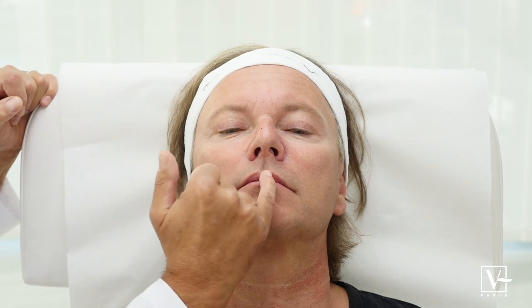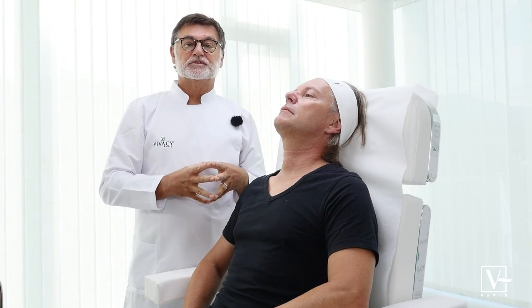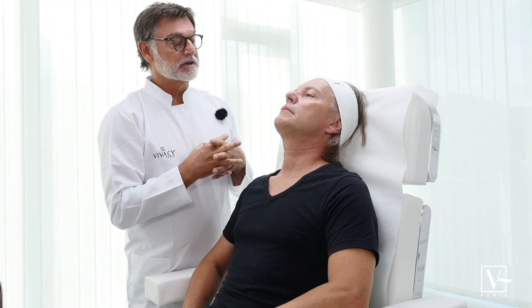The second idea would be to make the lips more symmetrical. We have an asymmetry, and Dan is okay to make them a little bit bigger. So we're going to use the new Stylage Lips Plus for that area.